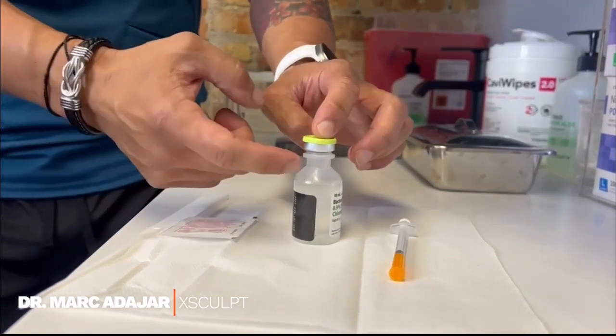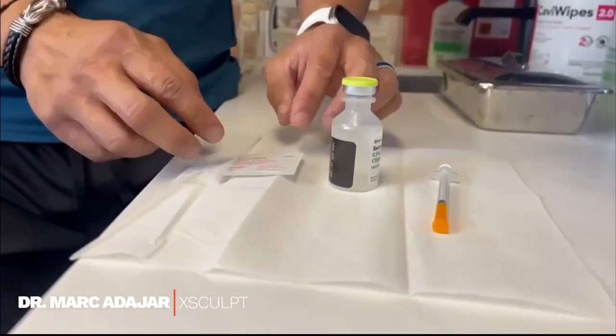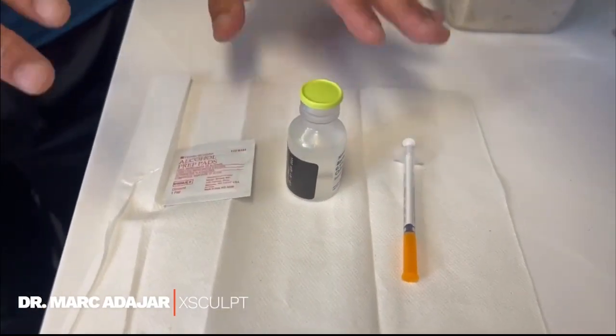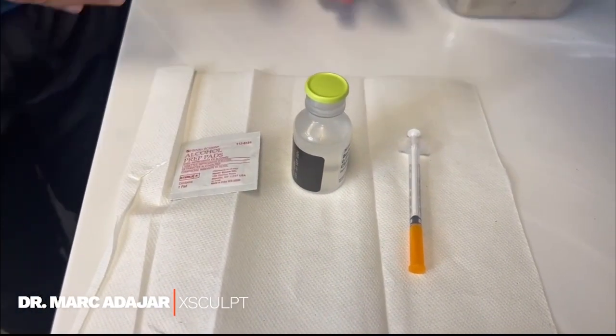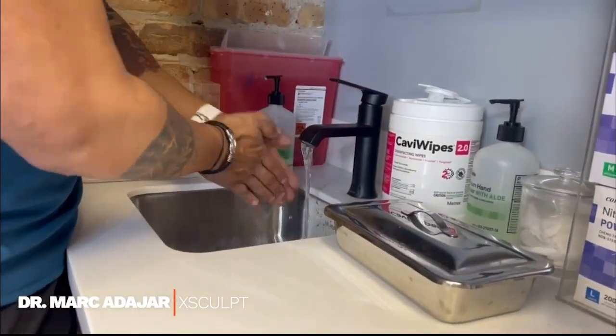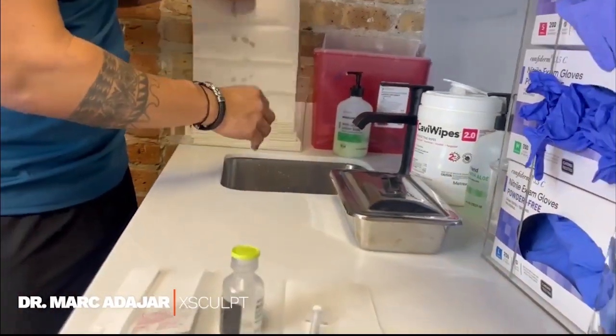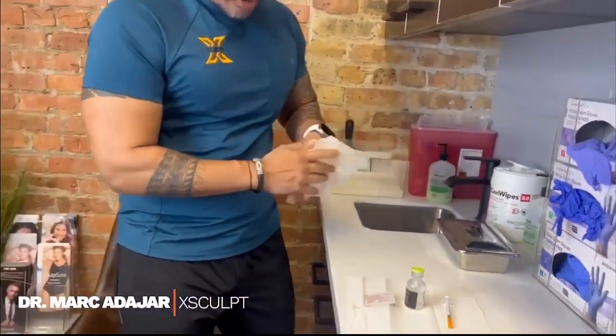It's a smaller, thinner vial — you'll have the top here and you should get an alcohol pad. The first thing you want to do before your injection is always wash your hands with soap and water. After that's done, we will prepare the injections.